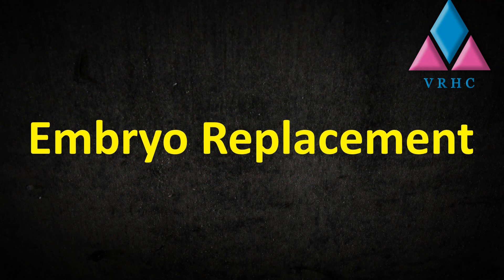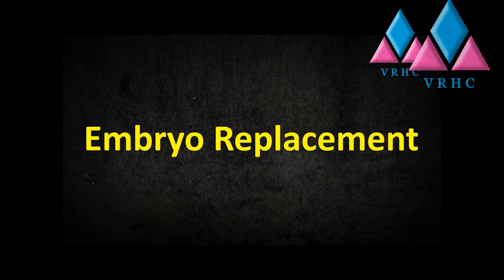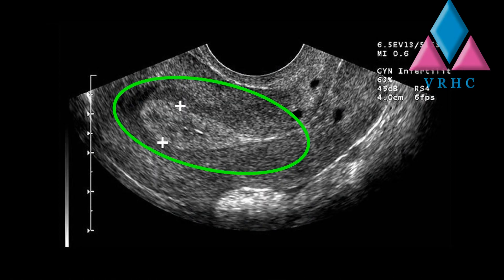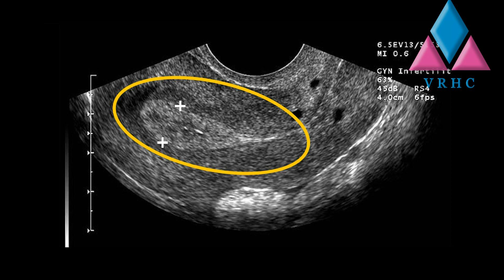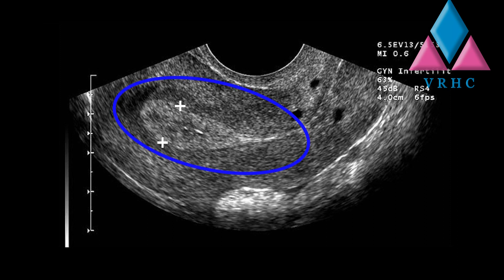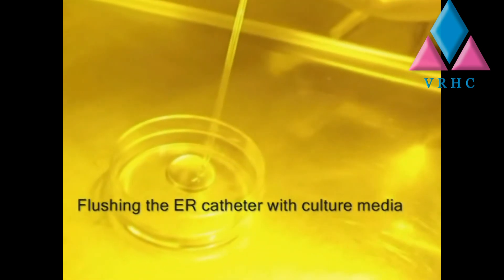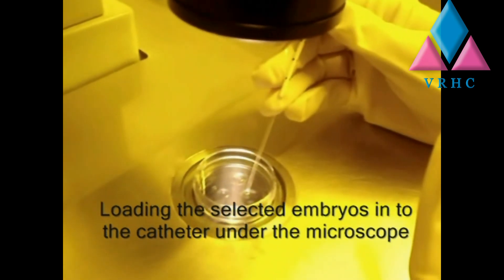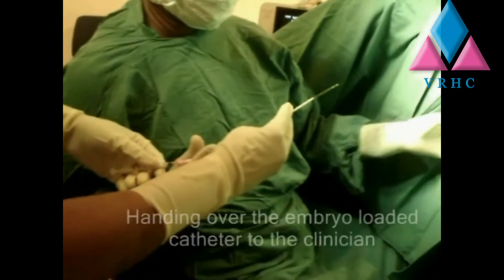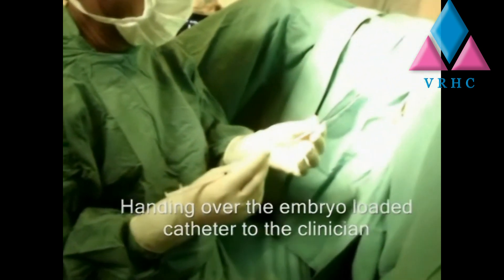Embryo replacement can be done in the fresh IVF cycle or later with frozen embryos. Prior to embryo transfer, the endometrium is prepared with oestrogen-containing drugs, or a natural cycle can be used. Endometrial thickness should be satisfactory before transfer. The fine catheter is initially filled and flushed with culture media, then the selected embryo is gently loaded into a soft catheter. The number of embryos transferred is usually limited to one or two.